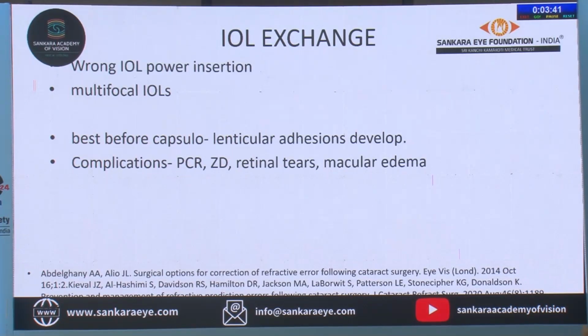IOL exchange, I have done mainly for wrong IOL insertions. Sometimes it happens, 4 diopters, 5 diopters, and multifocal IOLs. We advise it best before capsulo-lenticular adhesions develop, and of course if you have some complications.